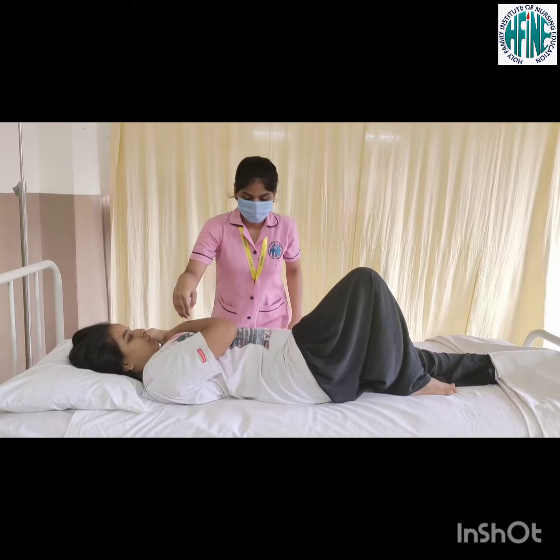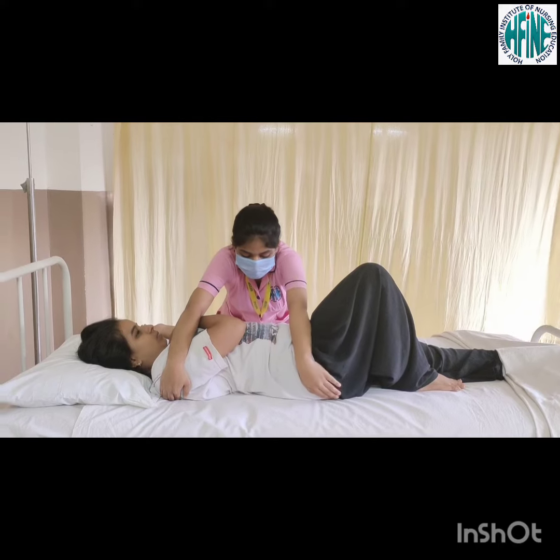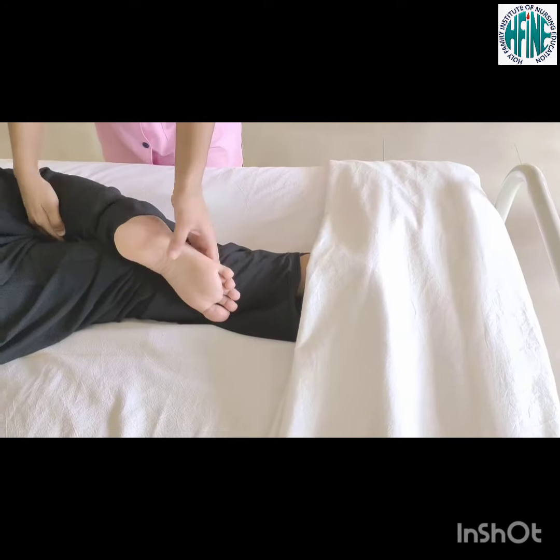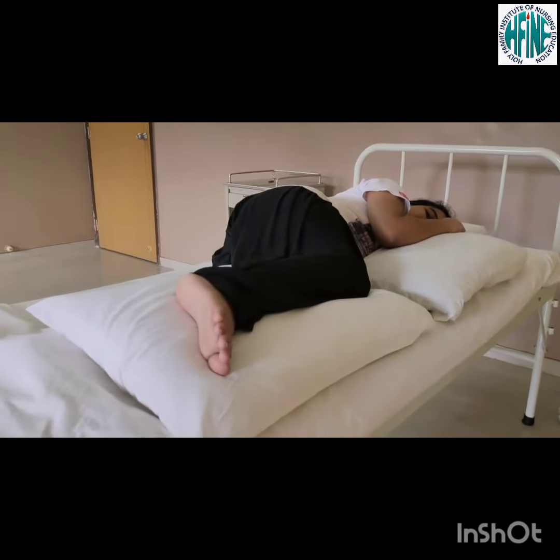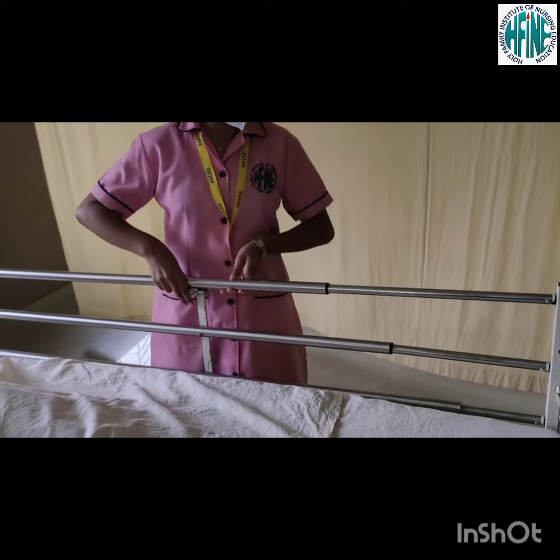Go to the other side of the bed. Place one hand on the patient's far shoulder and the other hand on the patient's far hip. Roll the patient to a lateral position. Place one pillow between the legs and another pillow under the hand.